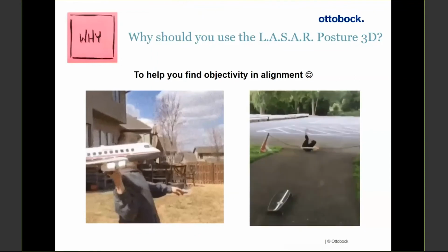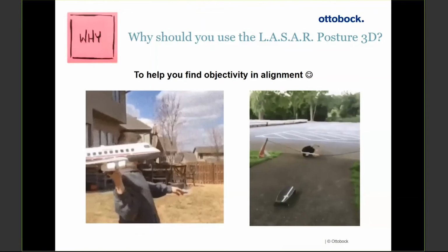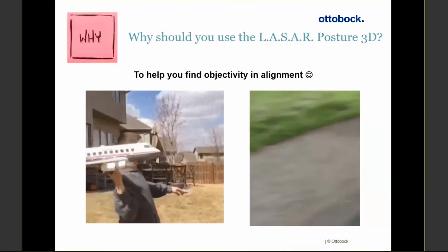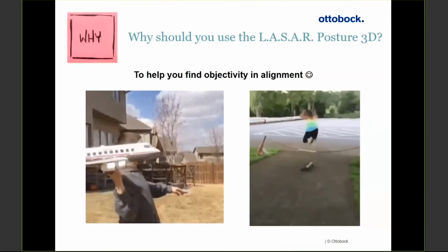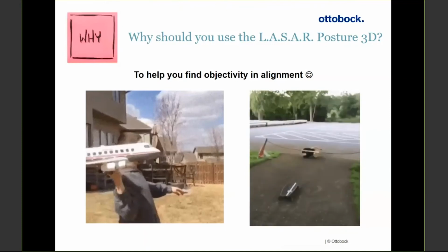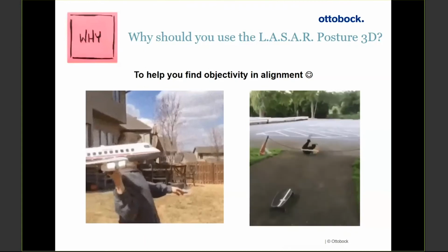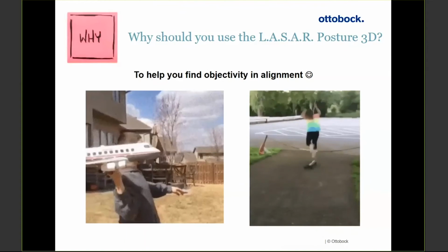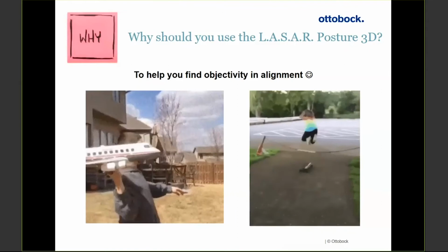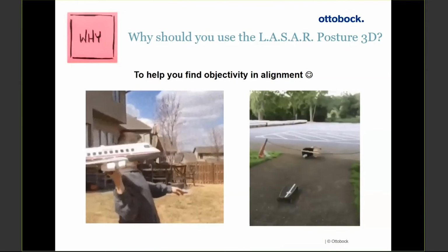And so we use visible landmarks, anatomical landmarks, to help us locate the joints on the body. But the hidden things that we can't see are the ground reaction forces, the levers and the torques that are acting. And it's really, really important. These hidden values that we can't see are really the difference between safety in a prosthesis or an orthosis versus dynamics, or actually really finding that nice balance between safety and dynamics.